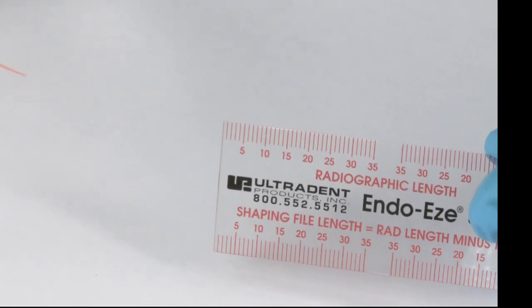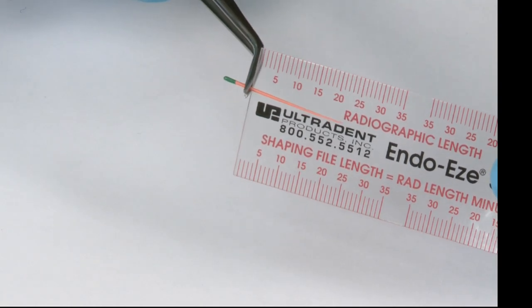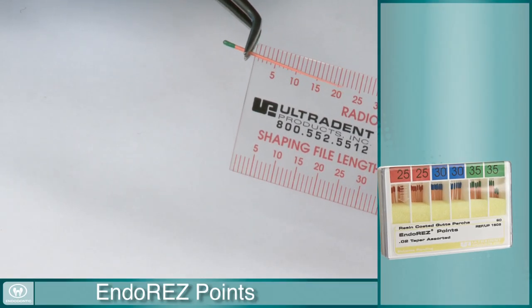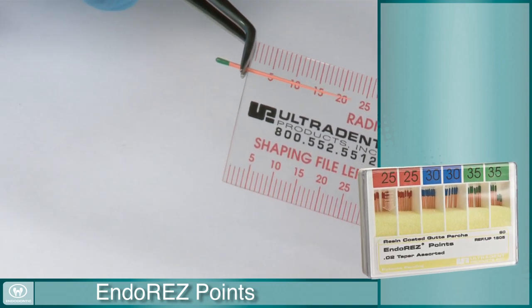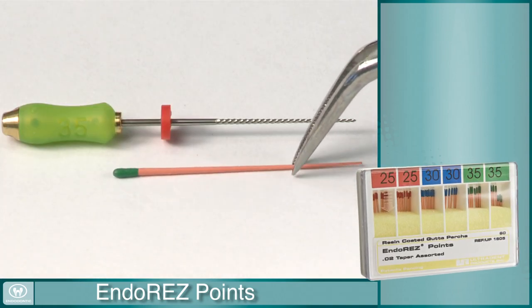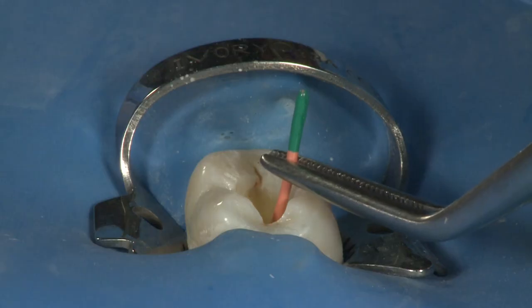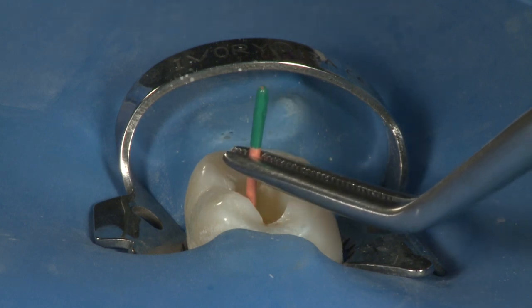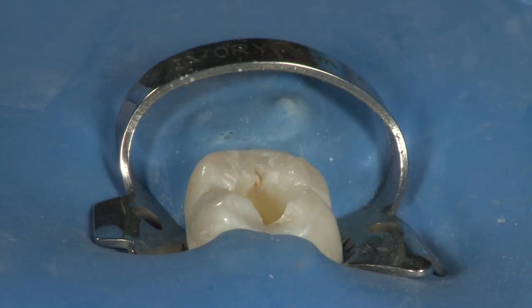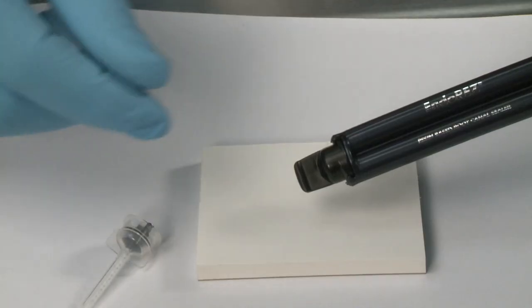Begin the obturation process by trial fitting an EndoRes point into the canal. This point should be measured and locked into cotton forceps at the pre-instrumented length. The size of the point will be determined by the last hand file used for apical enlargement. After gently sliding it to length, verify the fit by checking for a gentle tug back when removing the point. Lay the master cone aside while preparing the sealer.